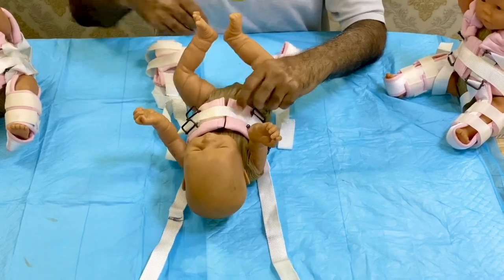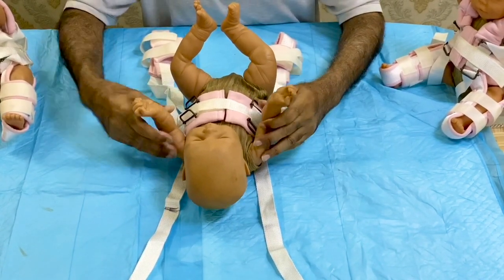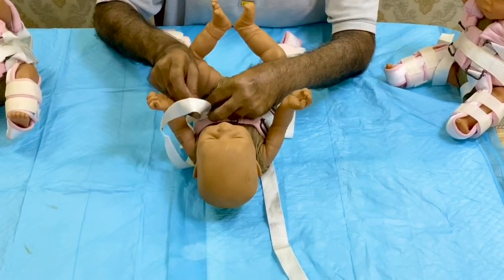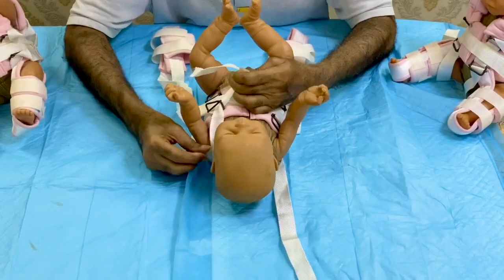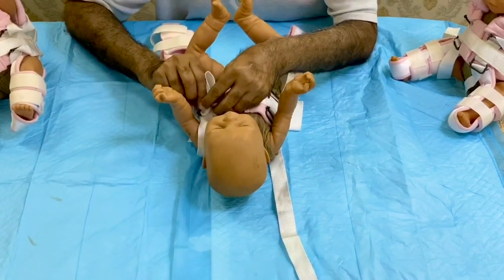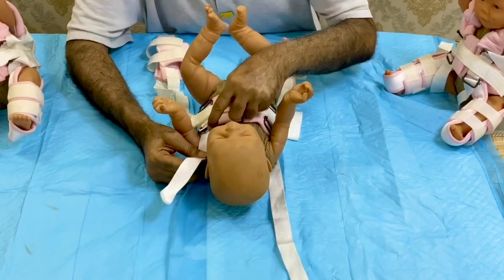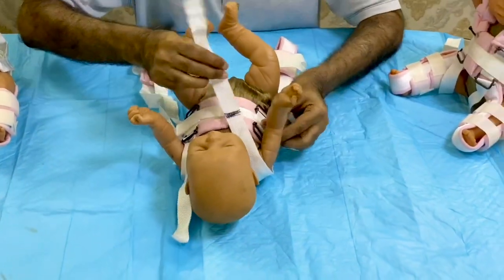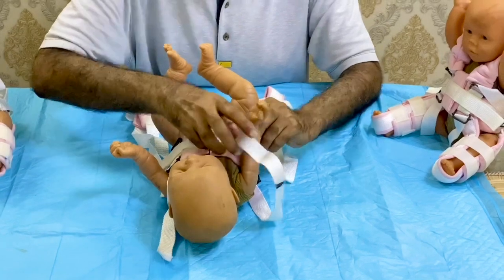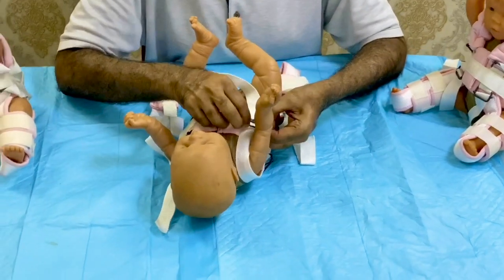To have easiness, this belt is positioned near the nipple line. Be careful about the axilla, then apply the shoulder straps for stability of the halter. Different types of velcro and belts are available. This is the position marking for reapplication. Once the shoulder straps are fixed, you must check the stability again — it should not be so tight around the shoulder.